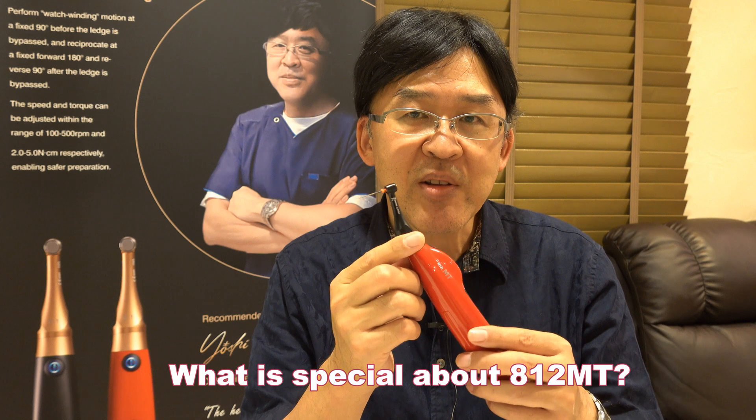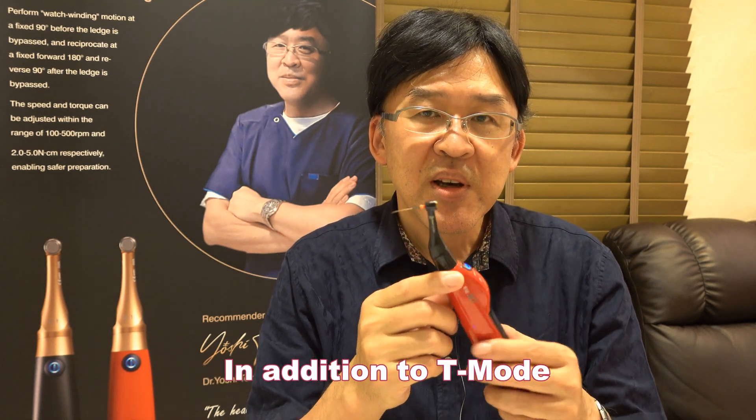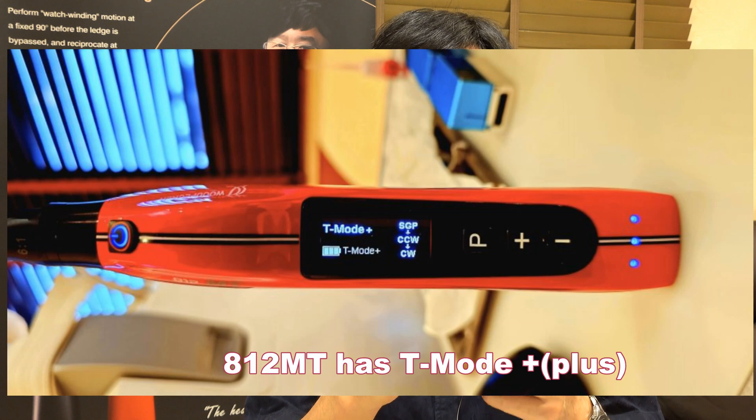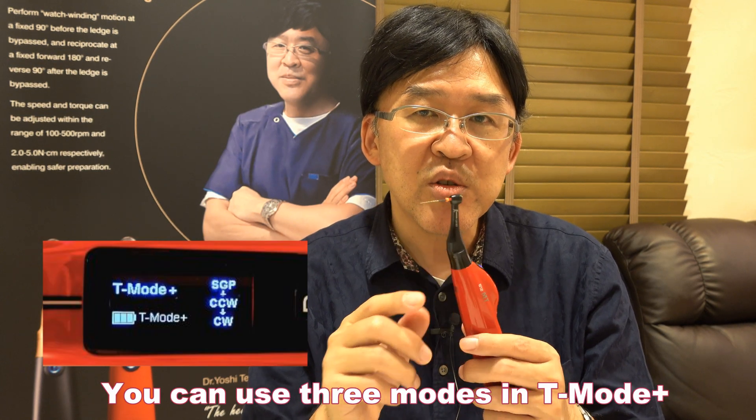What is special about 812MT? In addition to T-Mode, this one has T-Mode Plus. In the T-Mode Plus, you can use 3 modes.